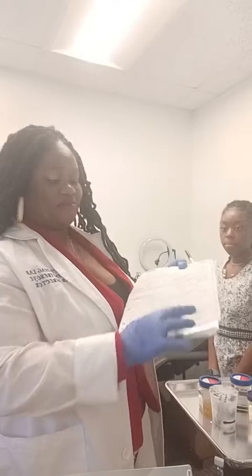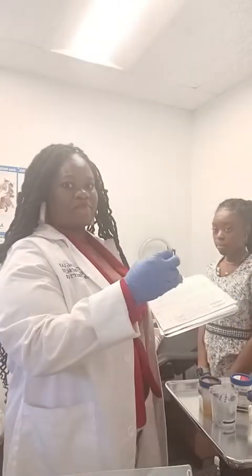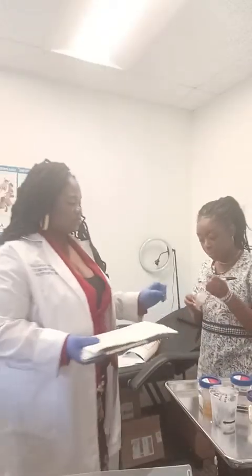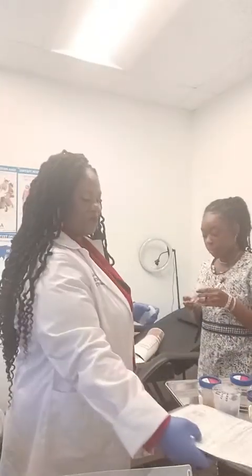Once that is done, what I'll do is the next step, almost the last step. Take out this label. I'm going to place label A on specimen A bottle. Place it neatly on the cap over the top, and specimen B, label B, on 15. All right. Once I do, Miss Isabel, could you please initial? Okay. You're going to give out both bottles to initial, right? Thank you so much. Make sure, again, she's not refusing. This is uneventful. She signed, she complied with all the instructions. Thank you so much. Now what I'll do as the collector, go ahead and date. I'm going to put the dates on both bottles. And at this point, we are almost wrapping up with the uneventful specimen collection.